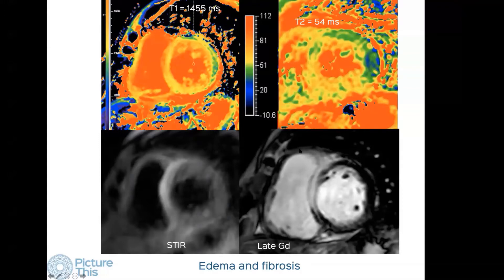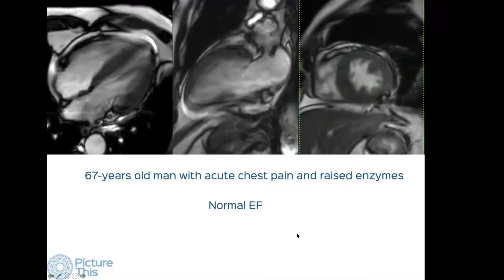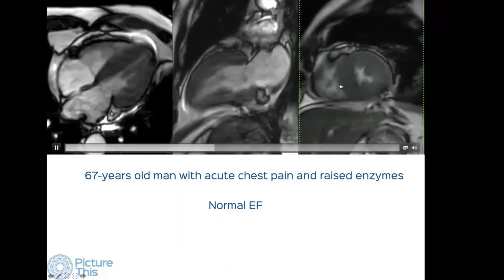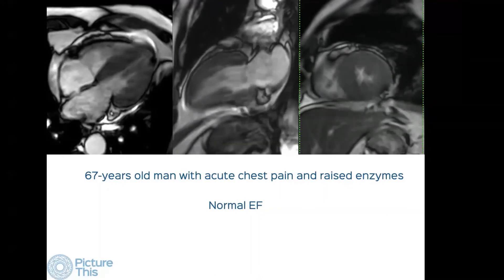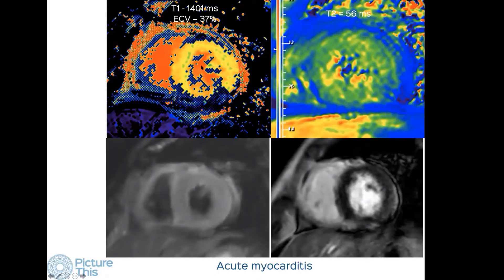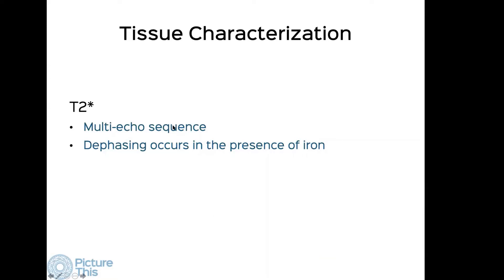Here is a 67-year-old with acute chest pain, raised troponin levels, and normal ejection fraction. On the four-chamber, two-chamber, and short axis views, contractility and thickening are normal. The T1 map is high, the T2 map shows high values, the STIR image shows only mild diffuse increased signal, and there is no late gadolinium enhancement. So there is edema but no fibrosis and no infarction — giving us a diagnosis of acute myocarditis.